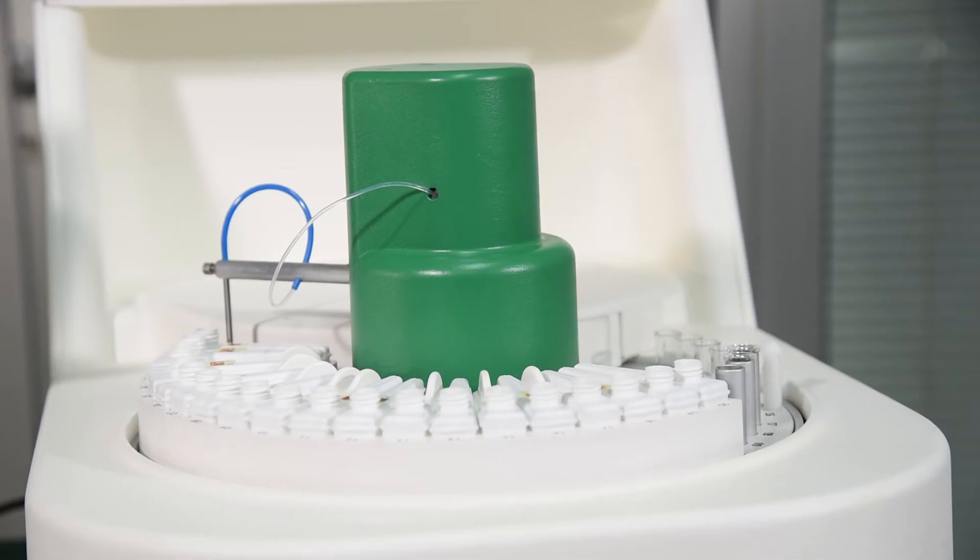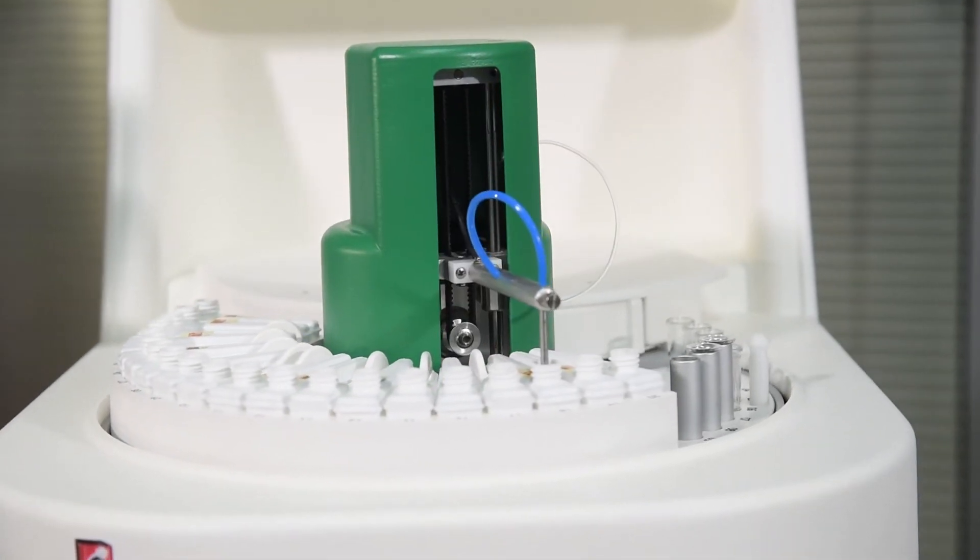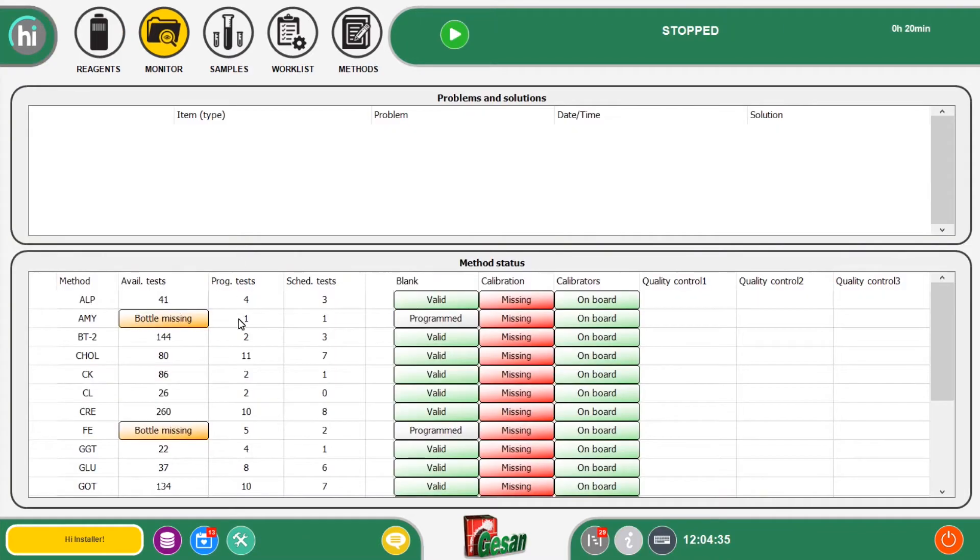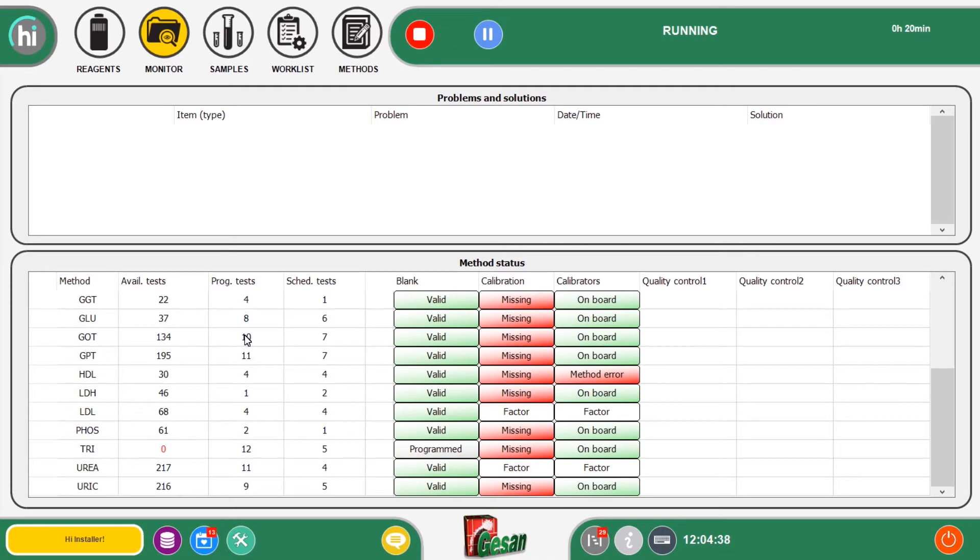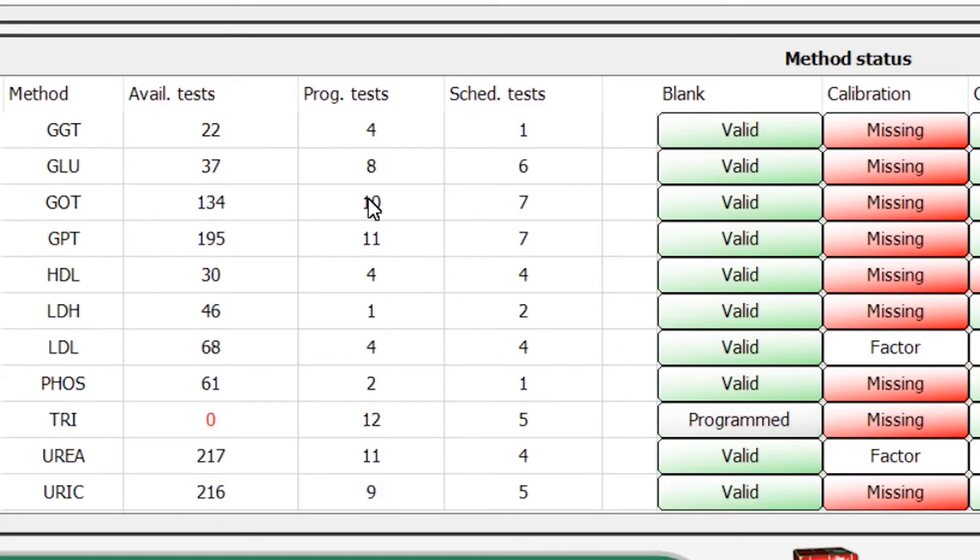Piccolo CHEM automatically controls reagents level, thanks to the level sensor present in the arm. It shows the operator the volume of the reagents, the number of tests available, and many other details through an inventory of the program at work and the status of the system divided by test analyte.